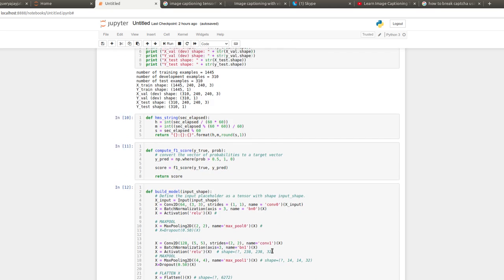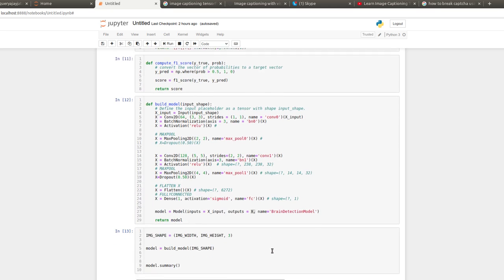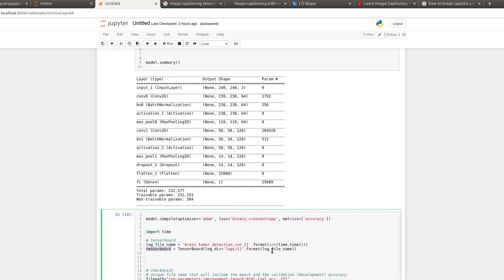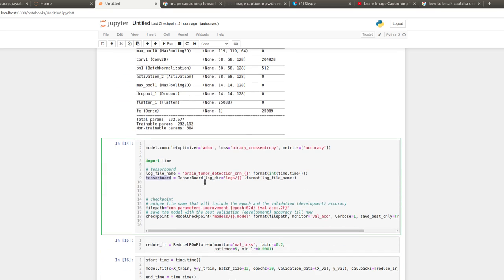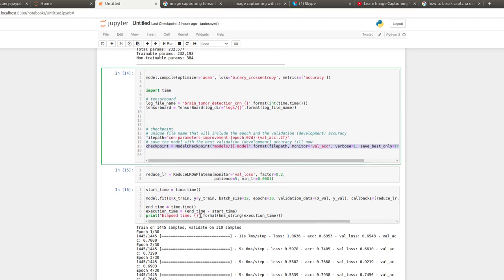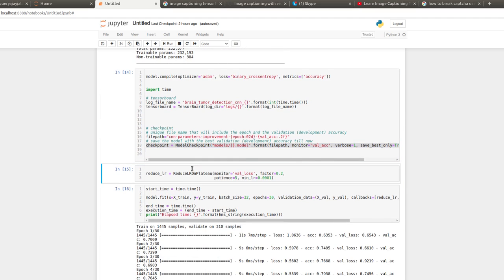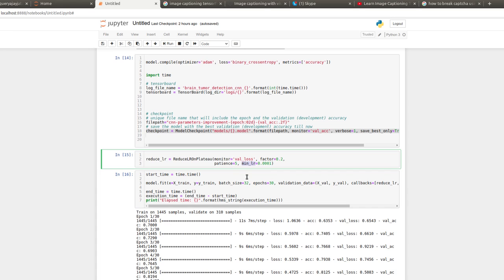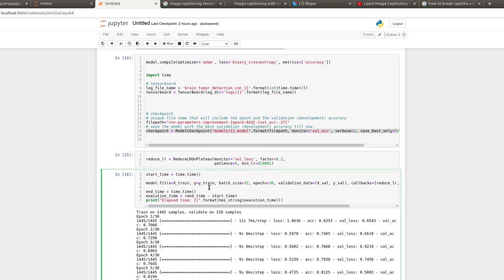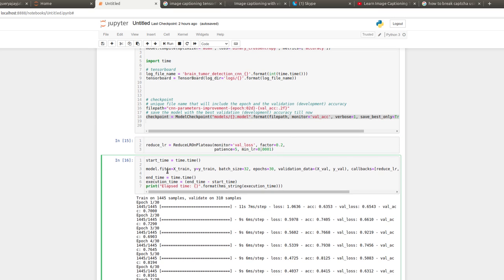The model.fit input variables are X_train and Y_train. Batch size is 32. Number of epochs I use for training is 30. Validation data is X_valid, containing 310 samples of images.